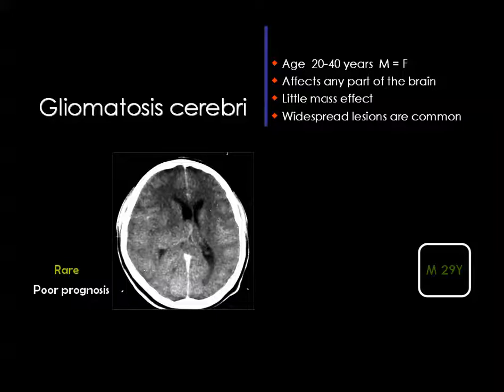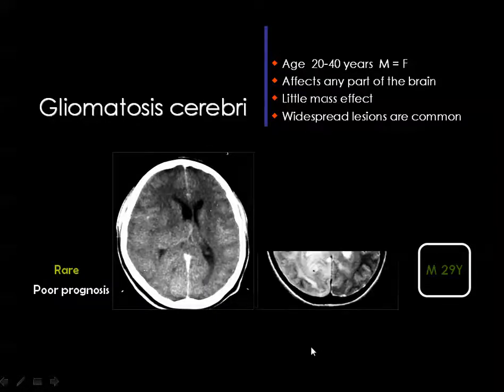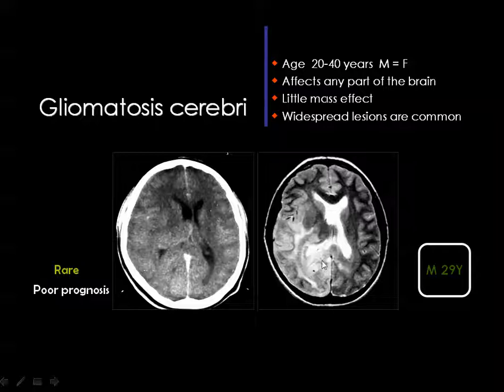And you remember the diffuse infiltrating glioma, or gliomatosis cerebri, is a lesion that is not seen in the CT and not seen in the MRI T1 weighted image, but seen in the T2 and the FLAIR, and is usually not seen in the diffusion because it has free diffusion. Whenever you inject contrast material, the lesion does not enhance. If you look carefully at the CT scan, you can see a mass effect exerted on the occipital horn of the ventricle, but you cannot see the tumor. And in the MRI T2 weighted image, you can see the tumor compressing the adjacent ventricle.